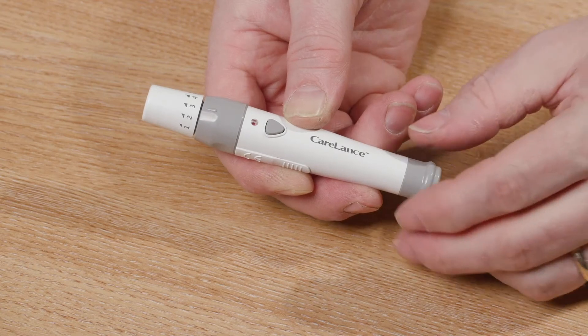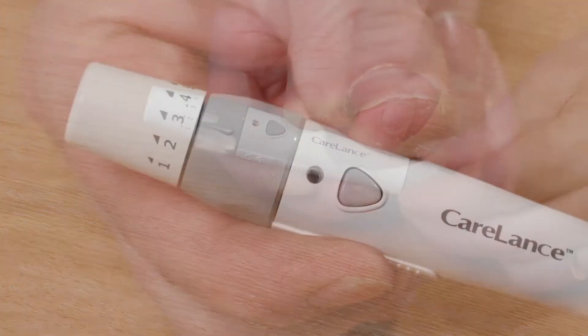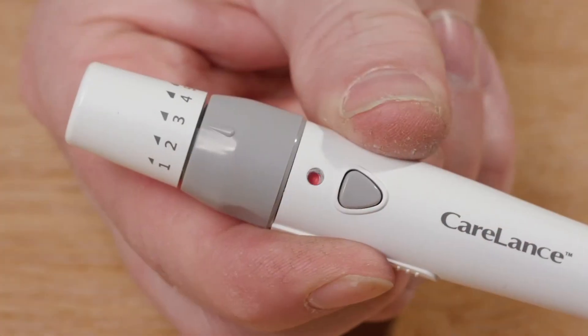Next, pull the grey end of the finger prick device to load the spring inside. Lastly, check that the release button on the side has changed to orange. Now for the important task of hand washing. Please wash your hands with warm water only, as soap and gels contain sugar which can affect the accuracy of your result. Washing your hands with warm water will also help bring blood to the surface, making it easier to carry out the test.